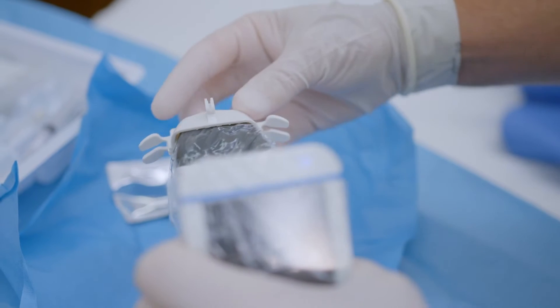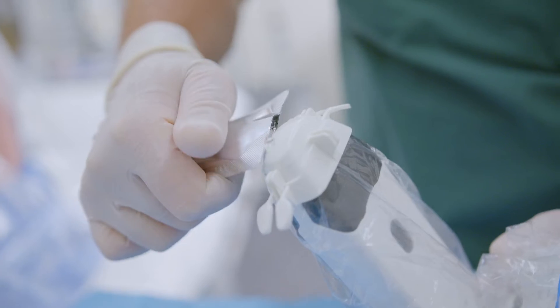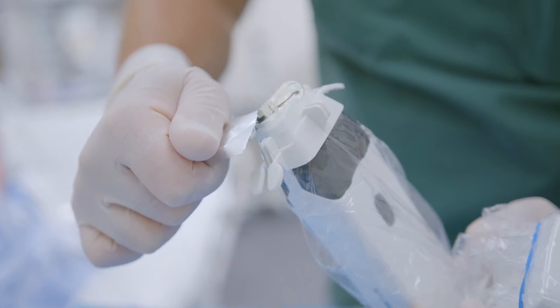Attach the locator needle guide. Apply sterile ultrasound gel and you're ready to scan.